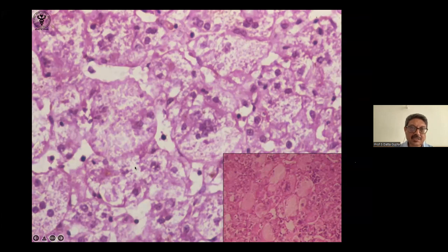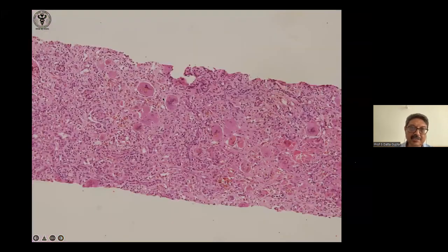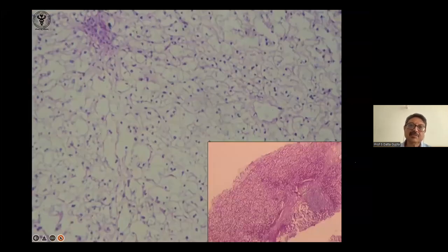Now, in children and in others, you not only get ballooning degeneration as a form of regenerating change, you often get three or more nuclei within the same cell. So when you get a large cell with 3 or more nuclei, you call that a giant cell. This is typical in neonates, and it's called giant cell hepatitis. See, more than 3 nuclei here, they are large cells, and this is called neonatal hepatitis, where you get giant cells.